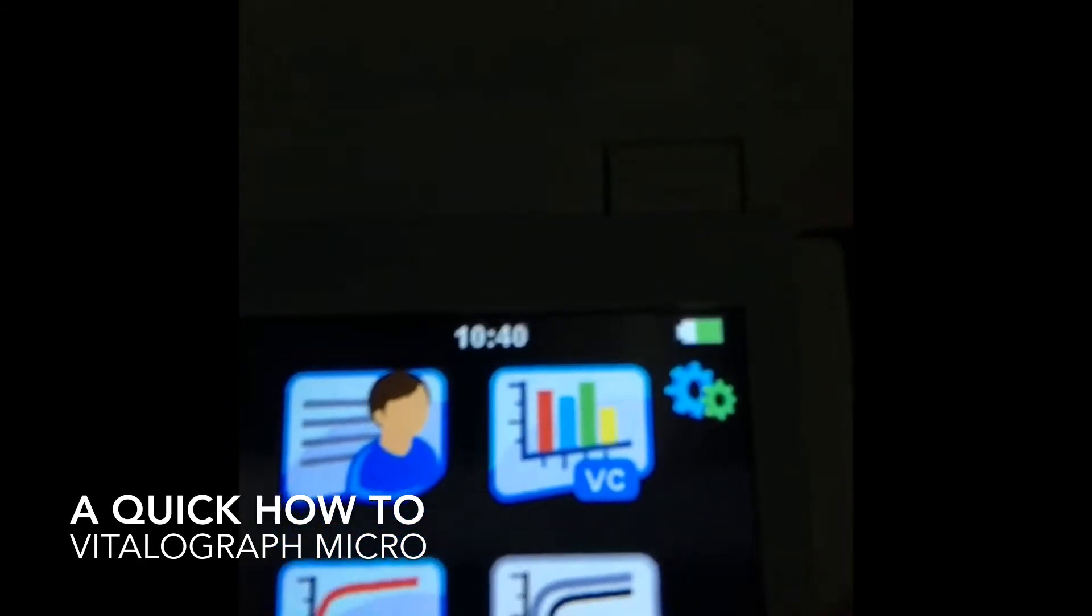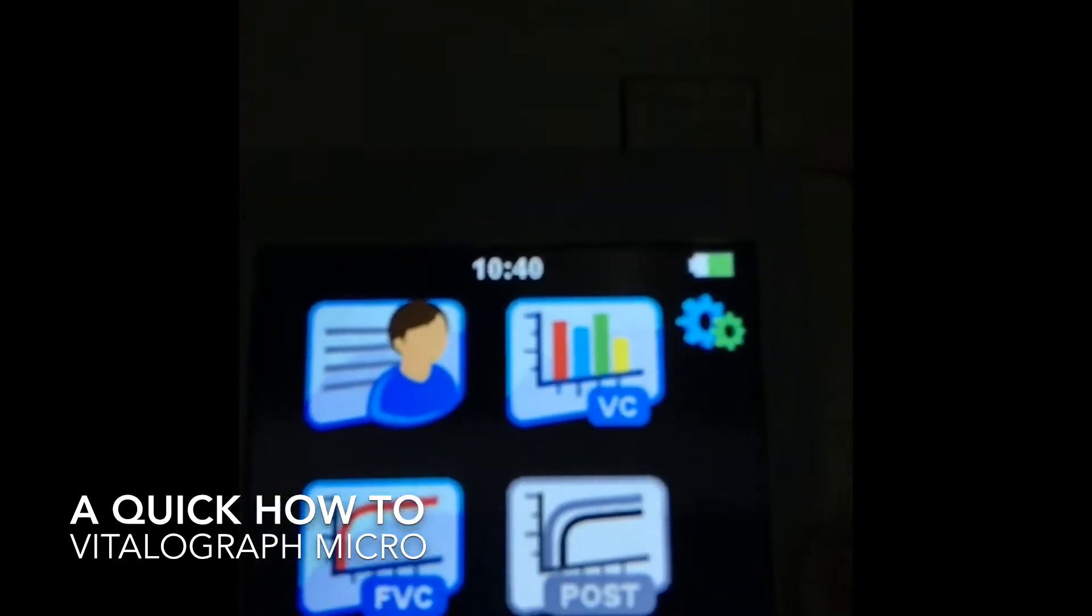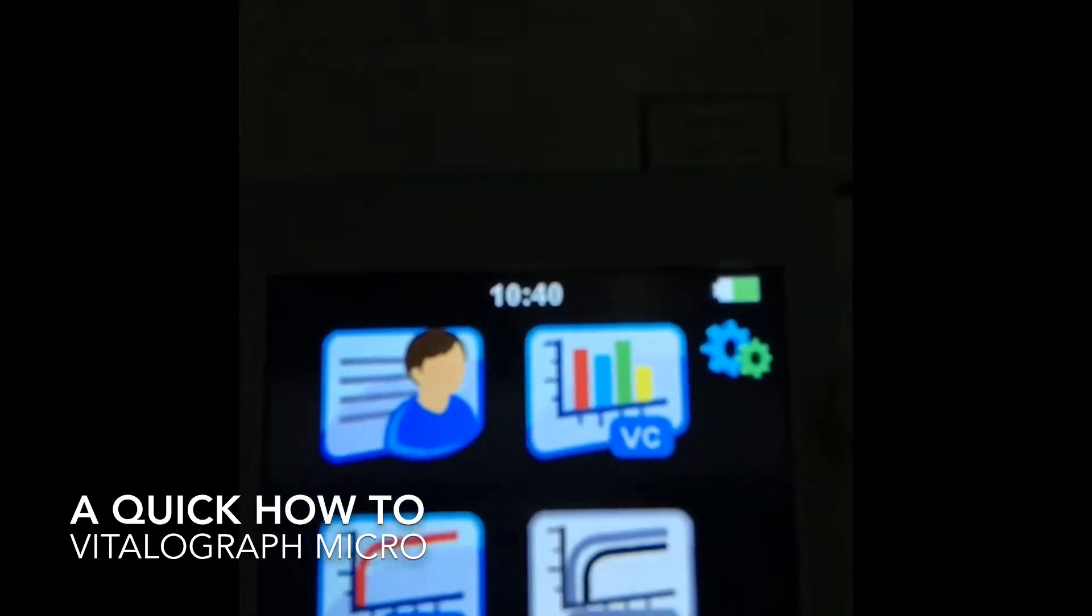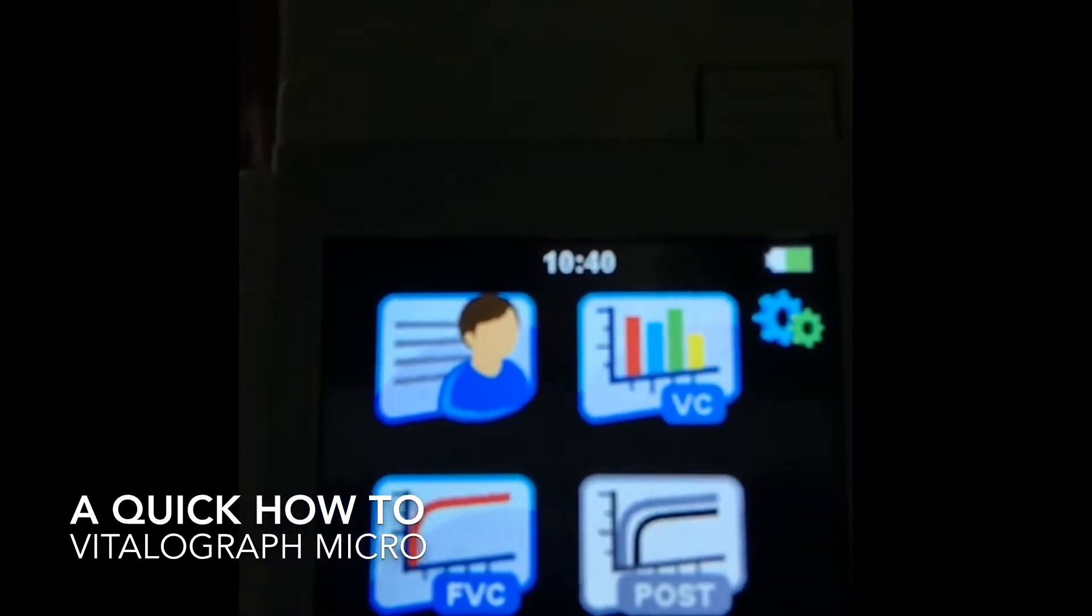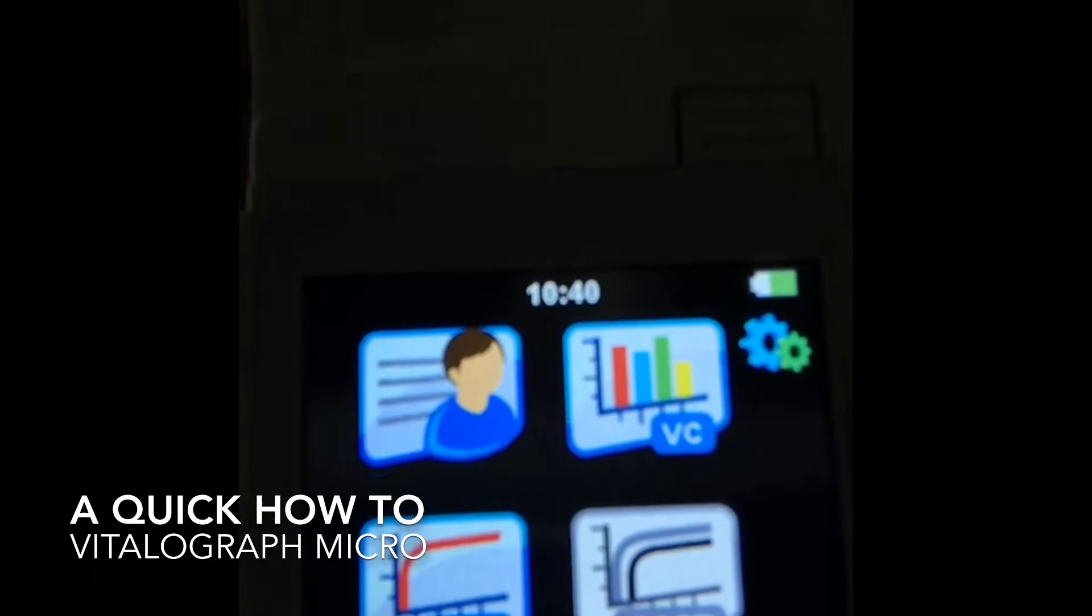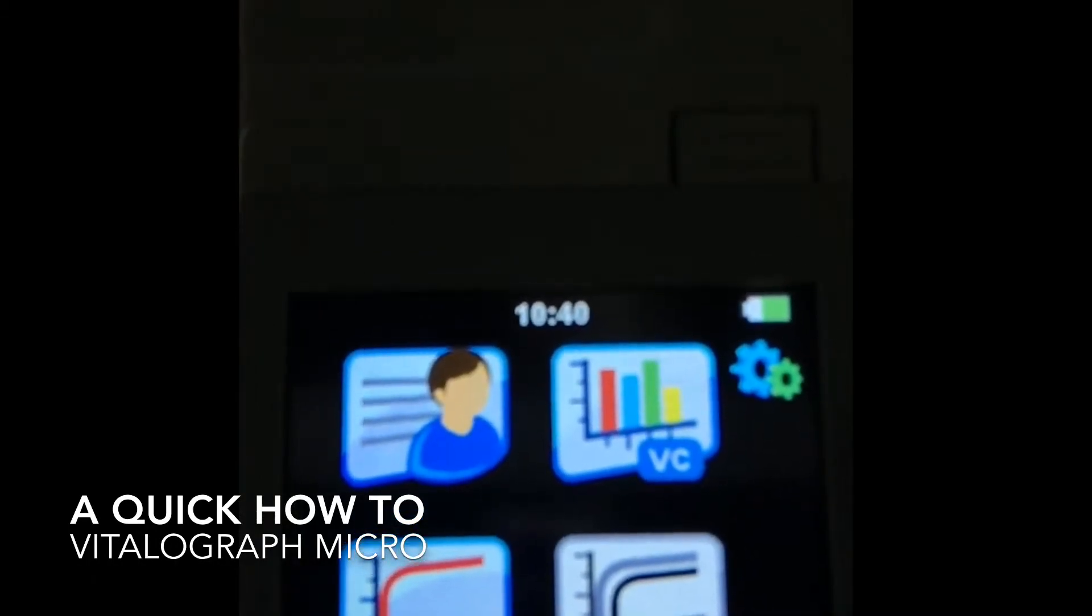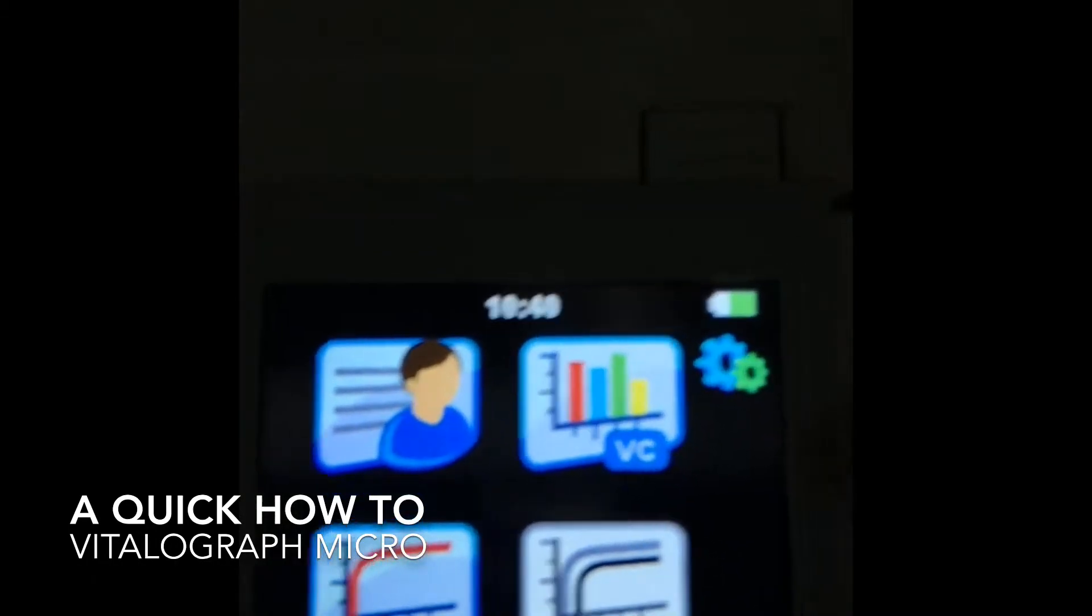So to test, we're going to select. If you want to do a slow vital check, you can do slow vital. However, most of our folks doing bedside studies and using this for screening spirometry, typically only use the forced maneuver.